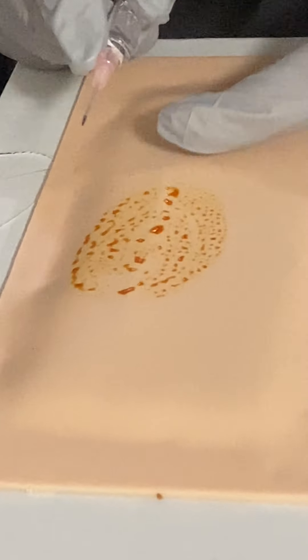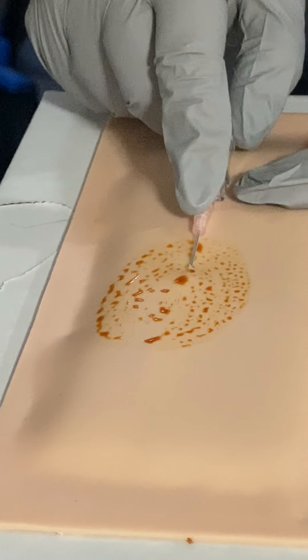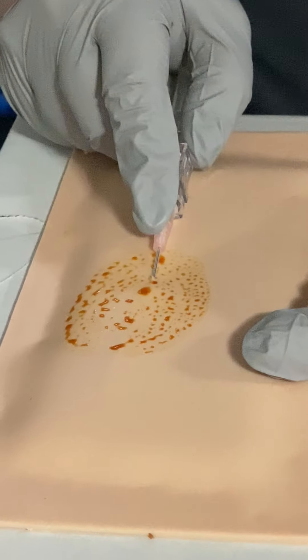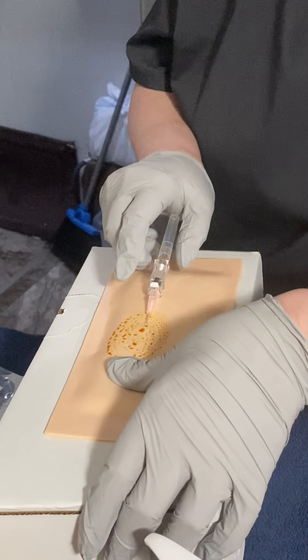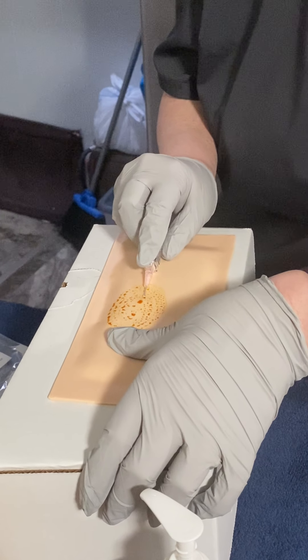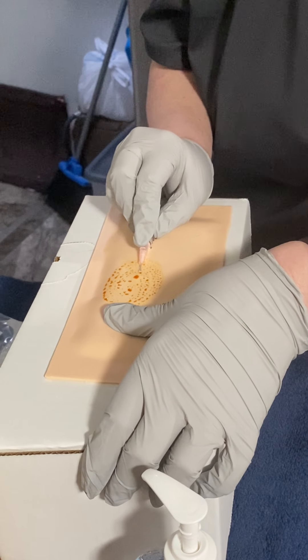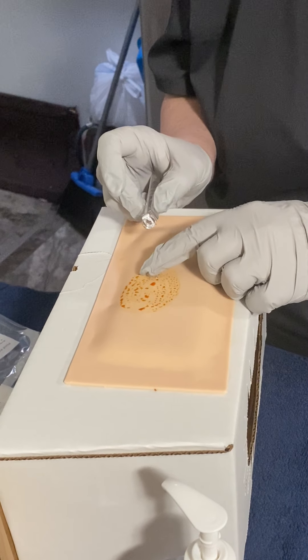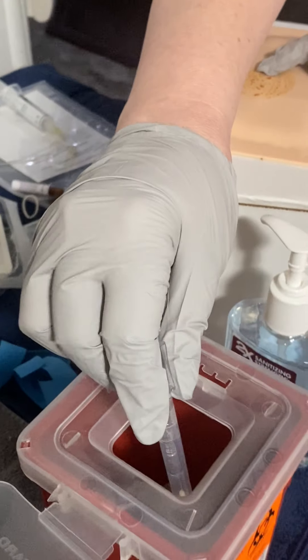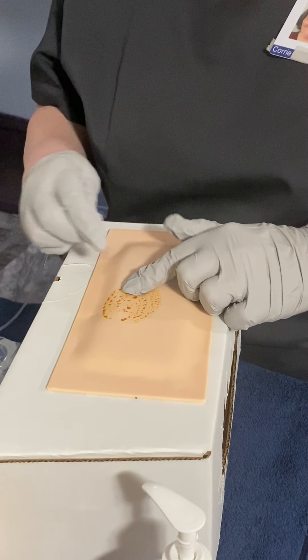All right, are you ready? Yes. Okay, here we go. I'm going to use my thumb to pull down on the vein to make sure that it's nice and taut. One, two, three — there, okay. That's perfect. Now I will loosen my tourniquet. I'm going to hold right here so that I don't have any blood coming out. I did get a flash when I did that. Now I'm going to release the needle and all that will be left in there is the catheter part. I'm going to put that into my biohazard container where my sharps go.